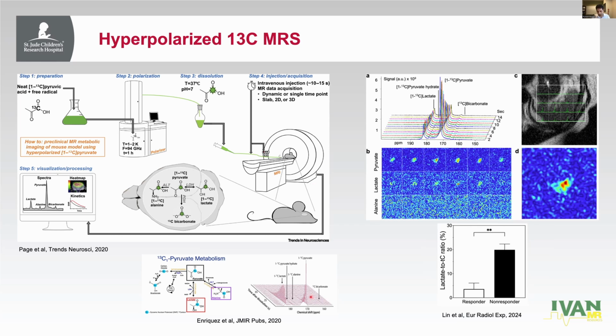So here's what hyperpolarized spectroscopy does. You have an initial dose of 13C pyruvate, and you're immediately starting to lose your polarization or 13C signal. And you see a turnover of lactate. It's forming, and then it's decaying also because of the 13C DNP being lost over time. But this amount of data is enough to fit your model to get kinetic rates of either glycolysis or neurotransmitter cycling, neurotransmitter energetics. So it's a very favorite technique to measure metabolism or metabolic imaging other than PET these days.